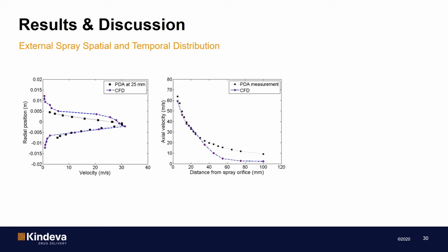Now, the next figure shows the spray center line velocity as a function of axial distance. So as you can see, again, our CFD prediction closely follows the measured data up to 35 millimeter. And from this point onwards, we can see that the CFD model predicts a greater deceleration rate compared with the measurement, which is likely due to the wall effects that we've got in the induction port. But the agreement is actually very good in the near-orifice regions as well.